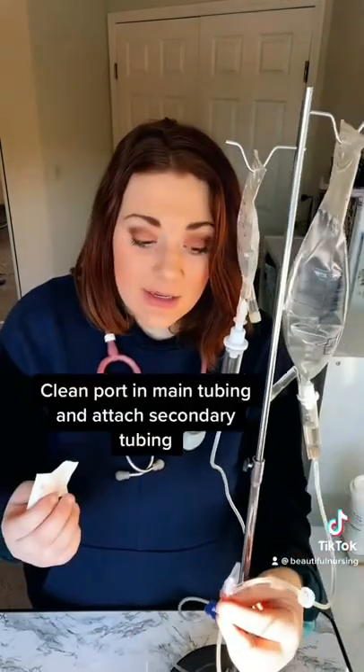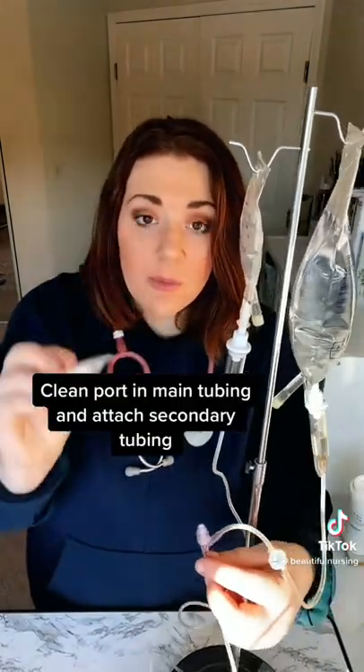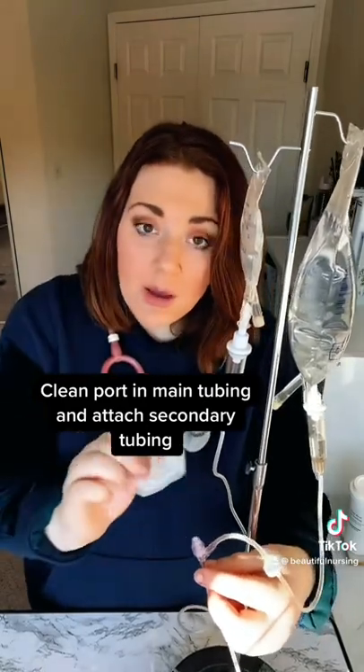We're going to connect our secondary tubing to our primary, but we need to wipe the hub for at least 15 seconds with some kind of alcohol wipe.